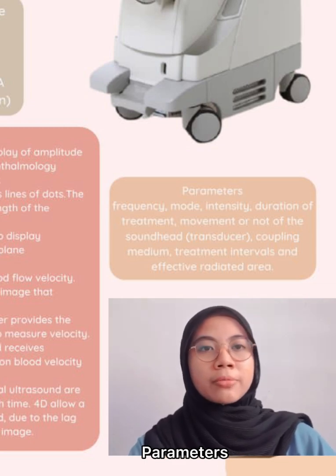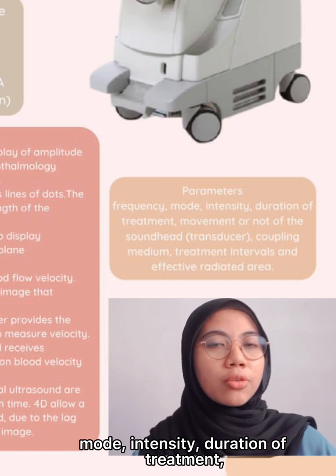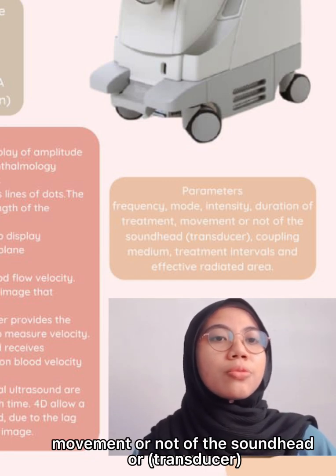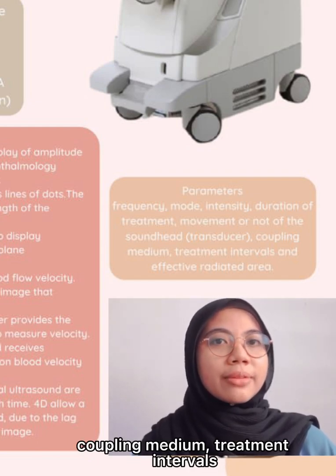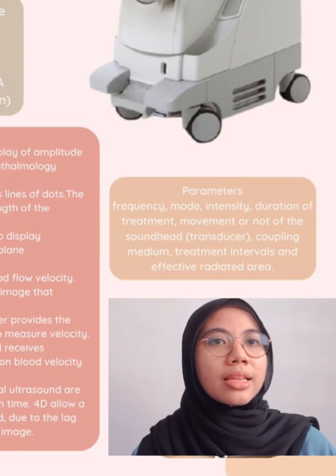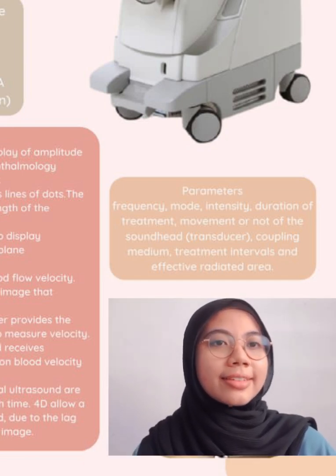Parameters. For parameters, this machine has frequency, mode, intensity, duration of treatment, movement or not of the sound head or transducer, coupling medium, treatment intervals, and effective radiated area.